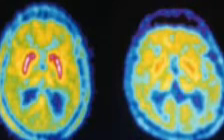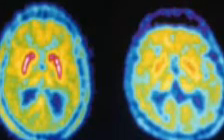Be sure to tell the nurse or technologist about any anxiety causing you discomfort. He or she may give you a drug to help you relax. In some cases you may have a CT and PET scan in the same machine during the same appointment. The CT scan will be done first and take about 10 minutes.